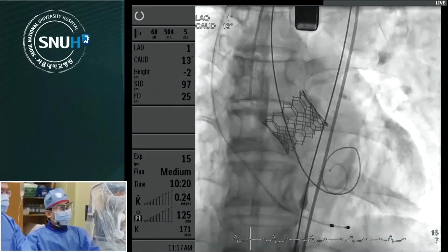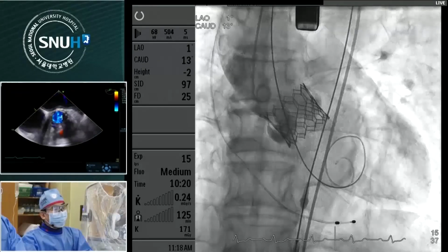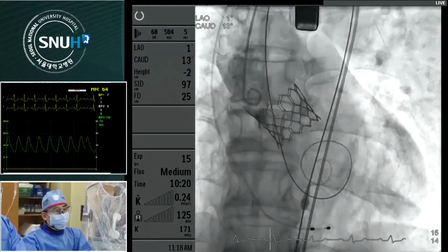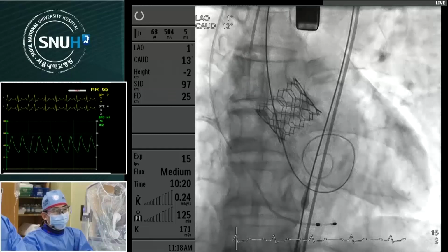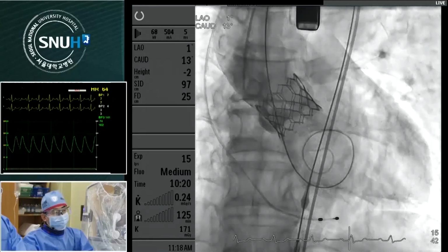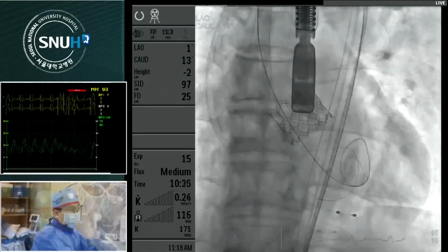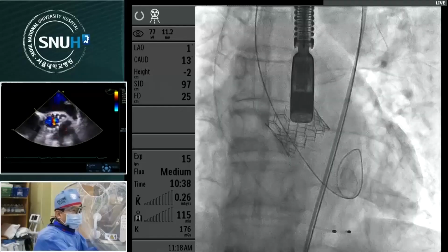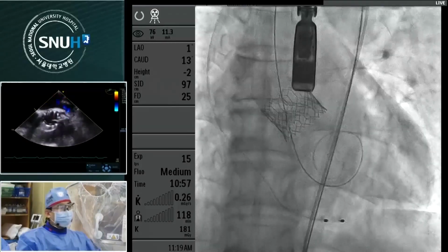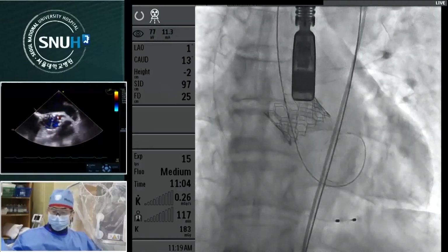We already performed 15% oversizing, and as you showed on EKG, you can see the LBBB. Thus, it is not necessary to do adjunctive ballooning. We already performed oversizing index more than 15%. There is LBBB. Thus, I exchange the wire with a pigtail catheter to more accurately assess the regurgitation, to check the angiogram, then decide to do additional ballooning or just finish. Most priority is angio with a large amount of dye in the low position of the pigtail, not high, small dye injection.